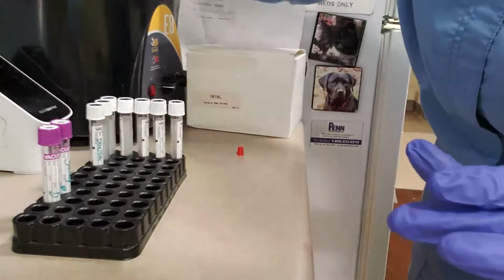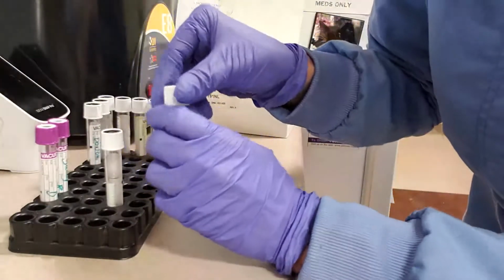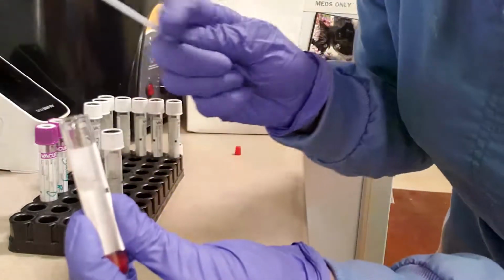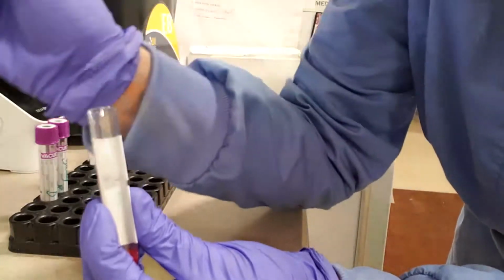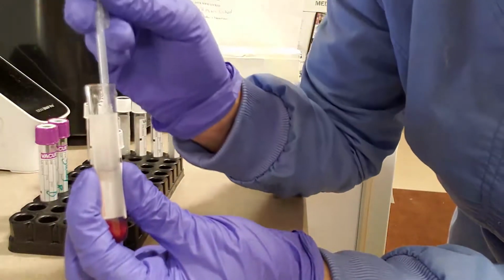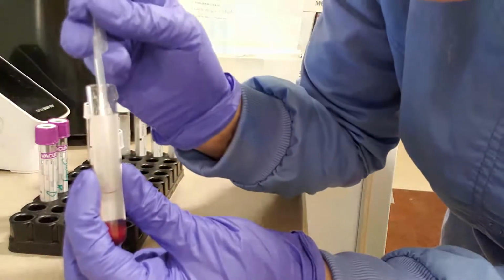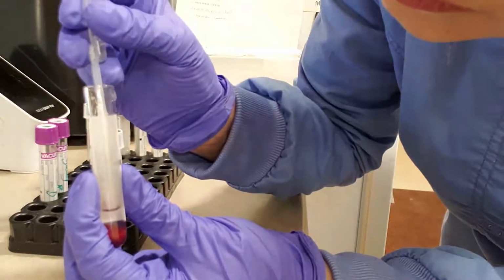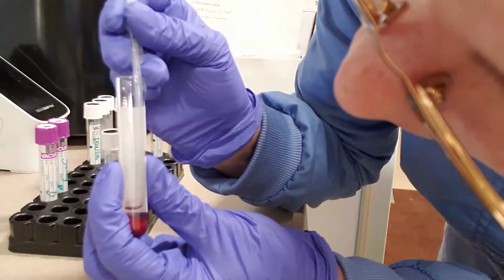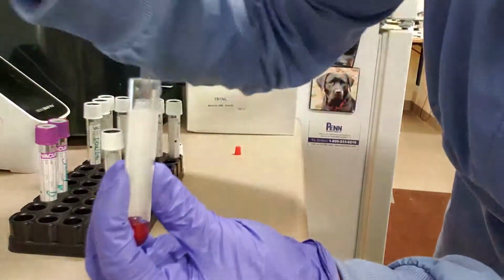Okay, so our centrifuge is done. So we'll begin our third wash. Coming out pretty clear. So we'll start with our donor. We'll remove our saline. As we get closer to the bottom, again, want to be very careful not to disturb our packed red blood cells. A little bit. There we go.